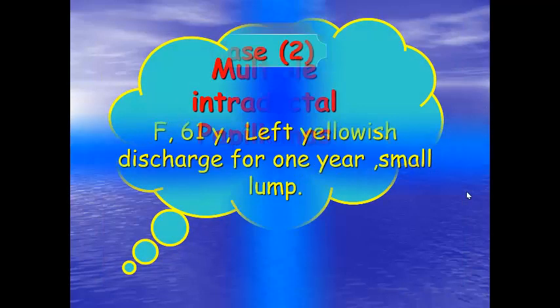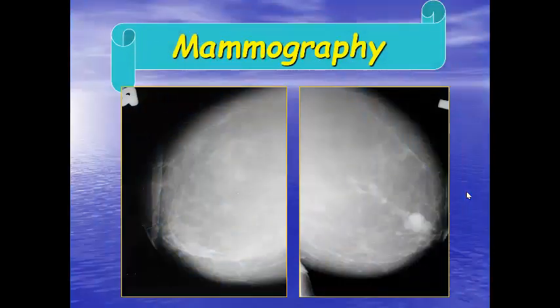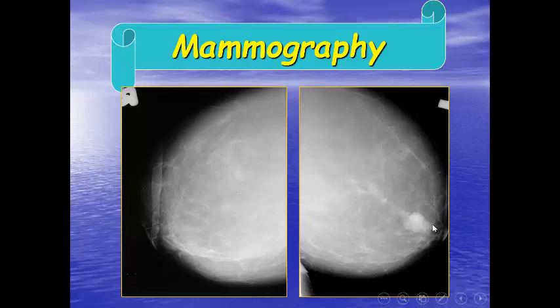This is a case of multiple intraductal papillomas. Another case: a 61-year-old with left yellowish breast discharge for one year who felt a small lump. The mammogram shows a lobulated, iso-dense mass with lobulated outline and a tubular structure seen here also. The mammogram can be assessed as BIRADS 3-4, but a spicule seen here raises the BIRADS to 4 until we do ultrasound.